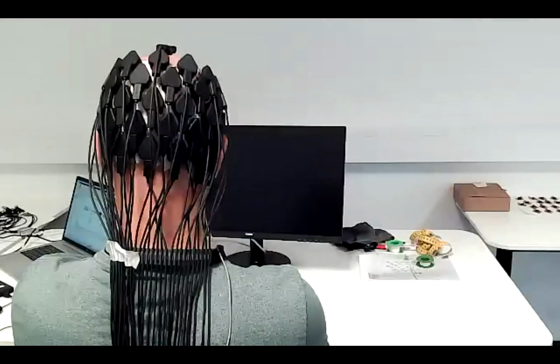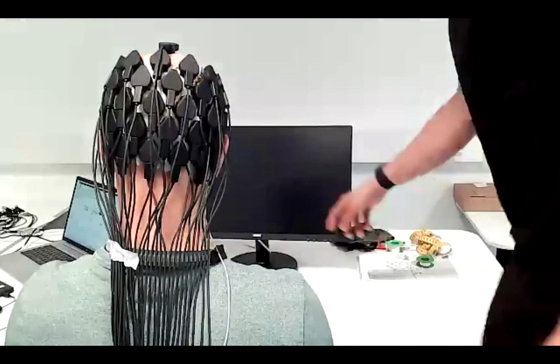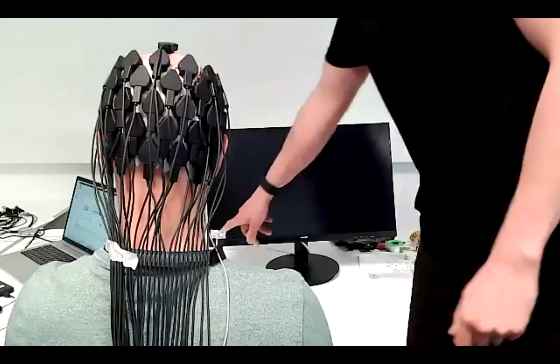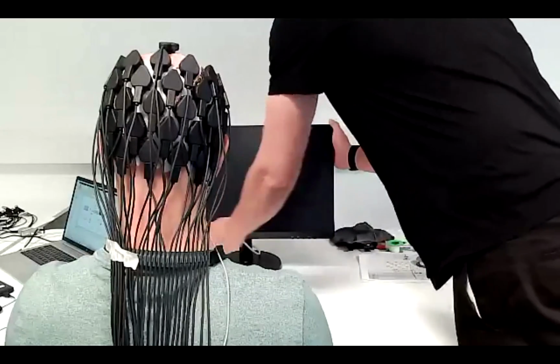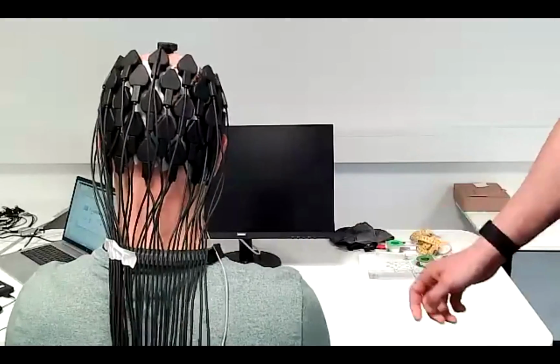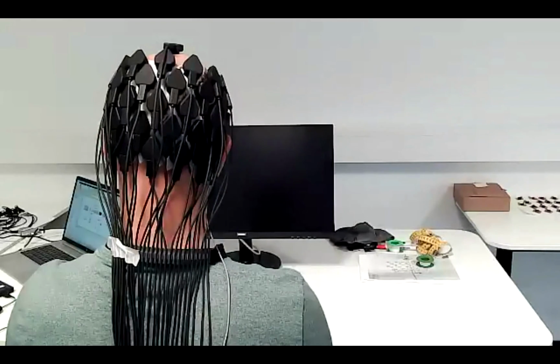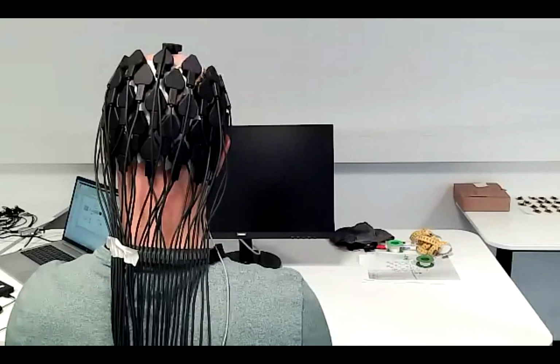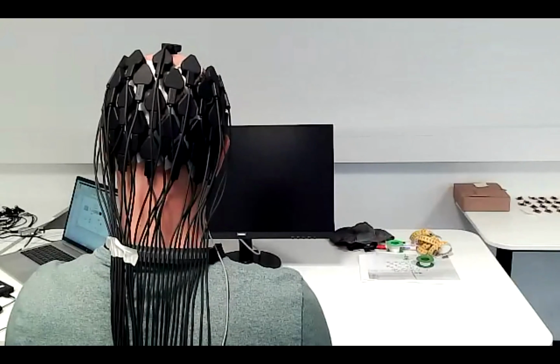We perform the experiments in front of the screen, and maybe you can see here. No, you cannot, but I will move the screen a bit so you can. So here on the bottom of the screen, we have mounted a photo sensor, and this one we feed back as a trigger. So we have the exact onset of the visual stimuli, and that's very important to have this hardware trigger for the exact timing of the visual evoked potentials.